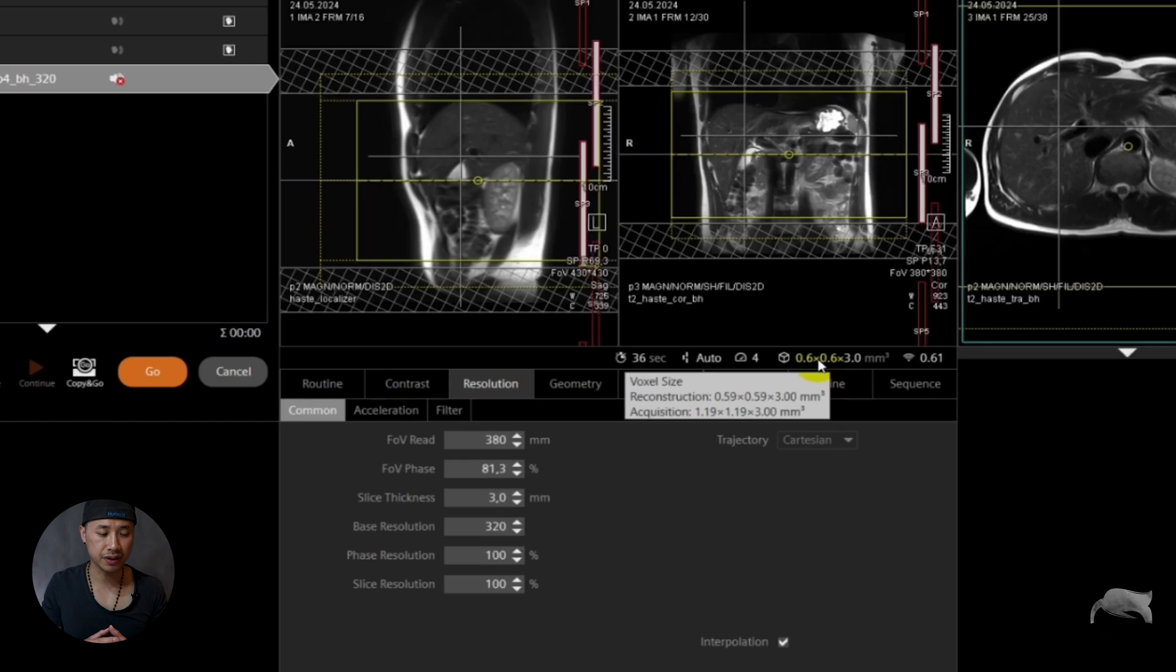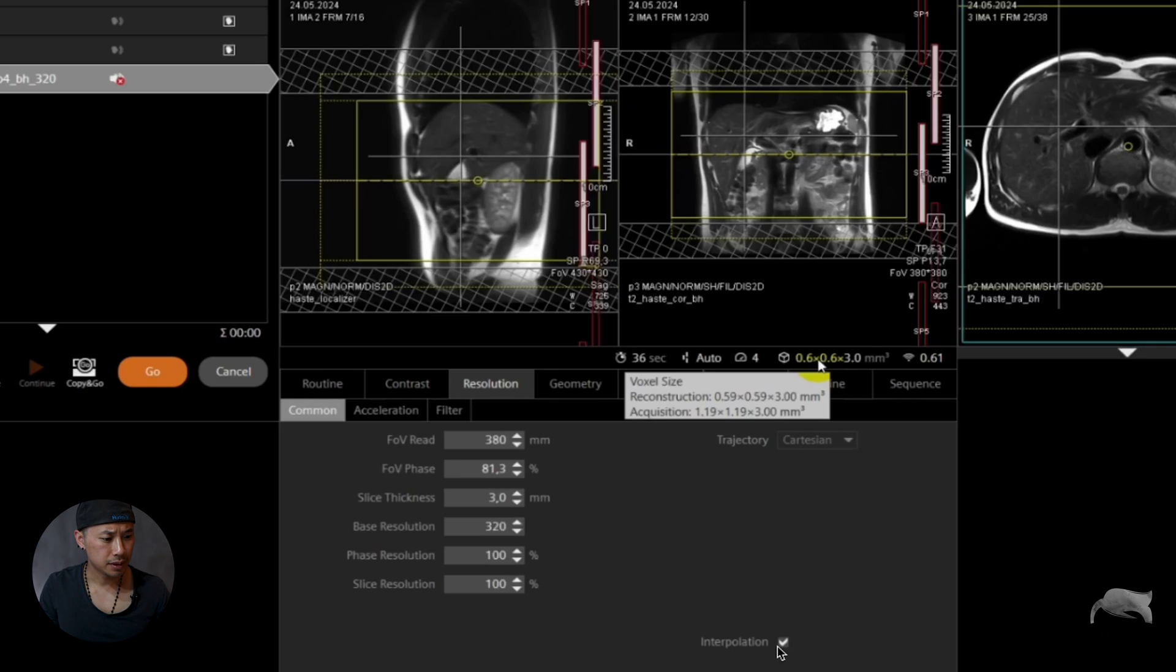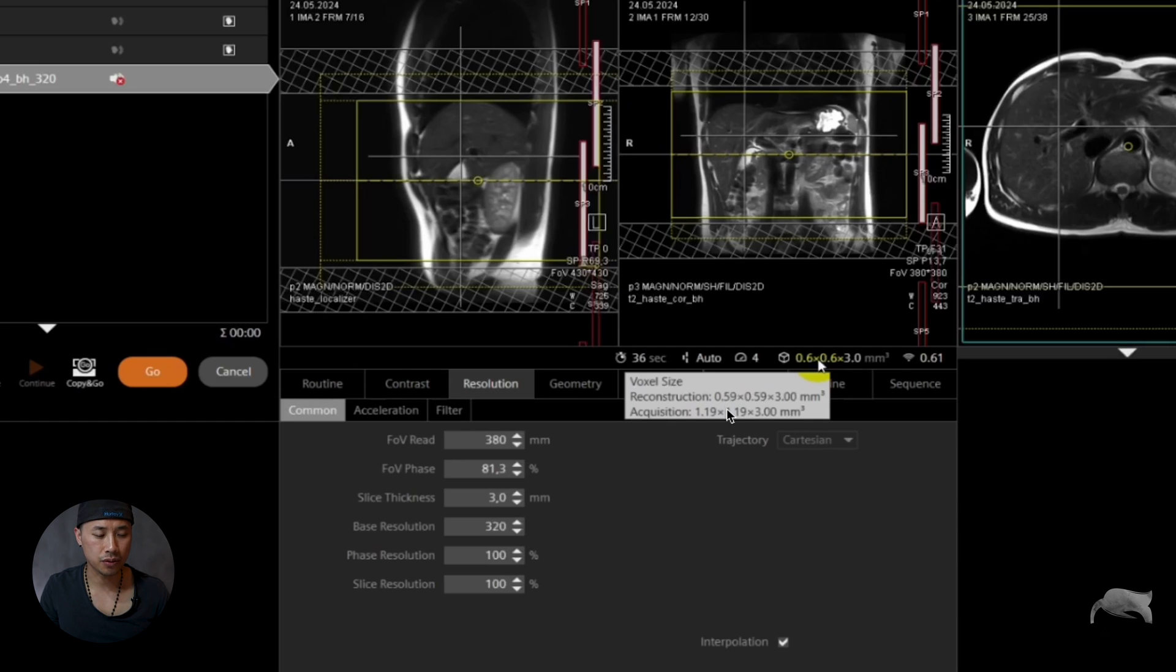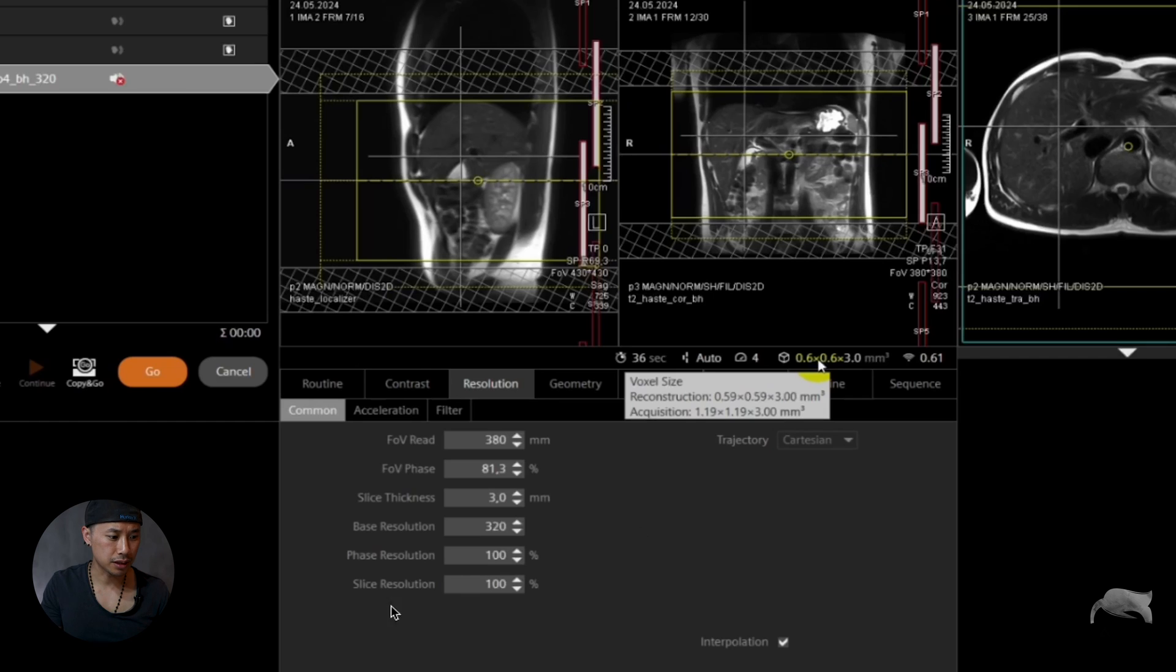And this interpolation button right down here, which I also had in my previous videos where you can look at, that button there will control the phase encoding and the frequency encoding, not the slice.